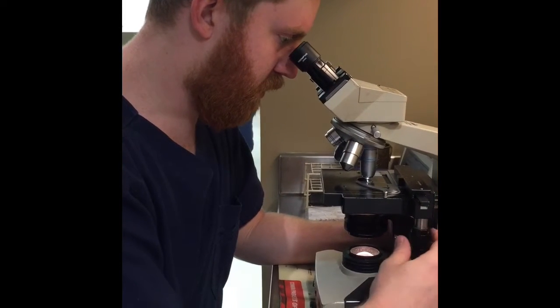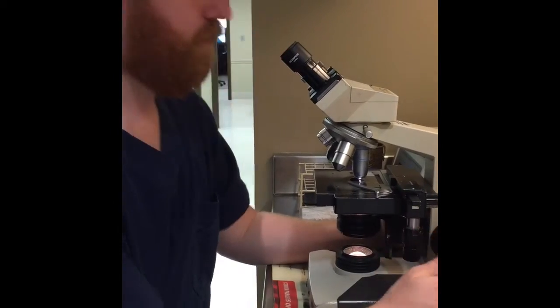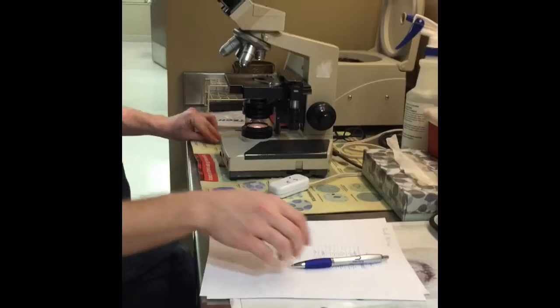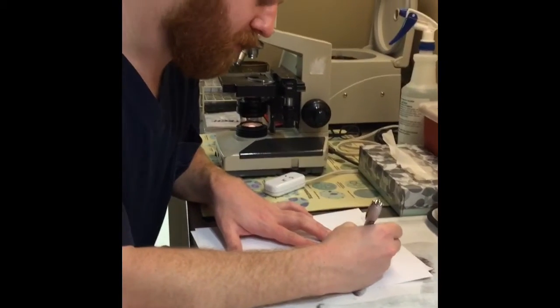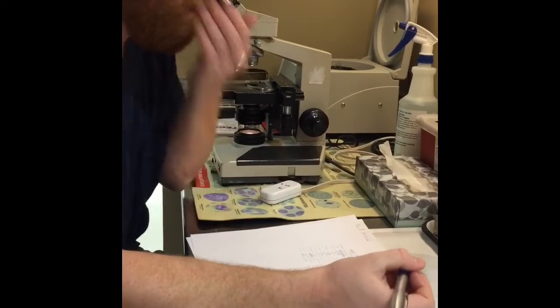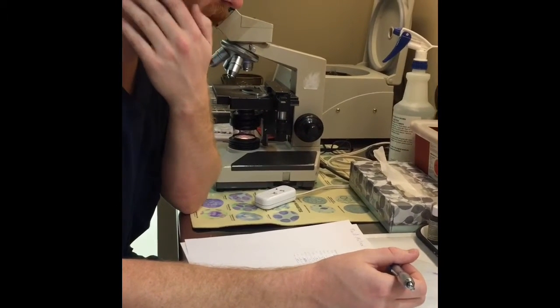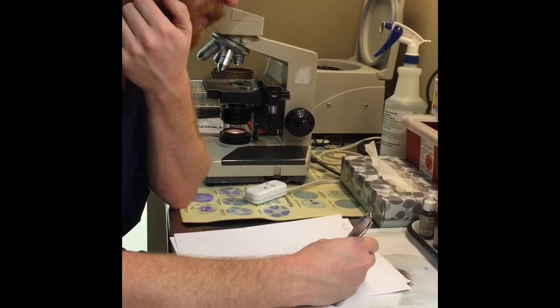Okay, and I'm approaching the end of the slide here, and I'm going to make a note of my results. Okay, so I did see some red blood cells. I would say that was a trace amount. According to the 10 fields that I looked at and counted, I didn't really see too many. It's nothing concerning. I didn't see any white blood cells.